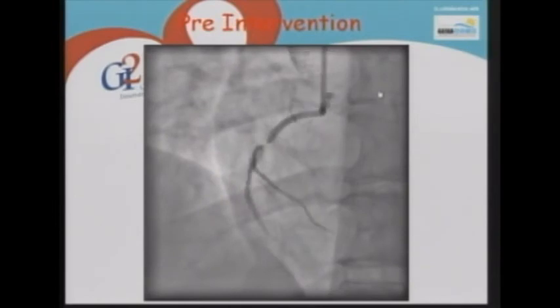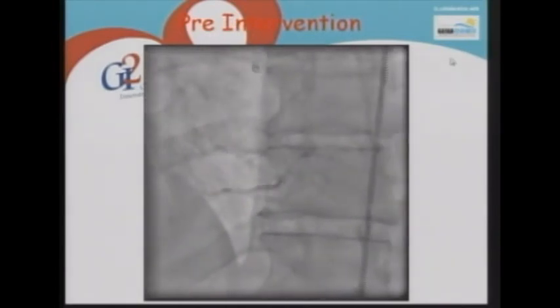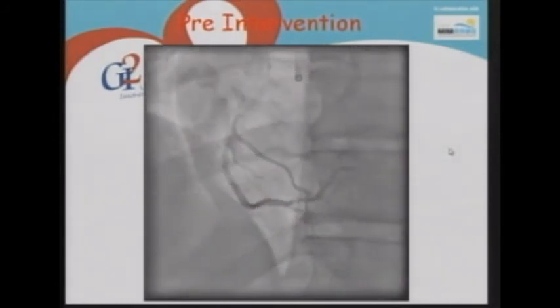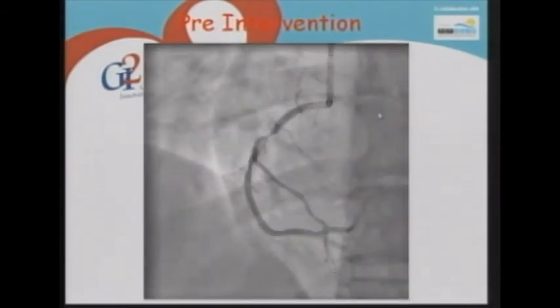So Alex, what are your plans? So we really appreciate the discussion, but we agree that with this positive nuclear study, anterior wall and inferior wall, and it's a relatively simple case, not to stage. So we went ahead and deployed a couple of Absorb, and Jose will describe. Breno, could you please move 3 slides ahead, please?